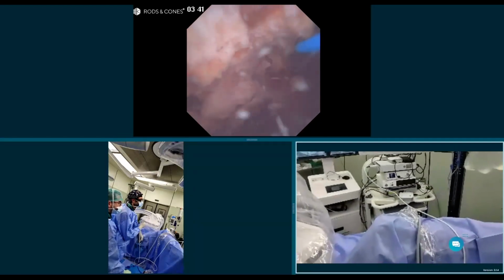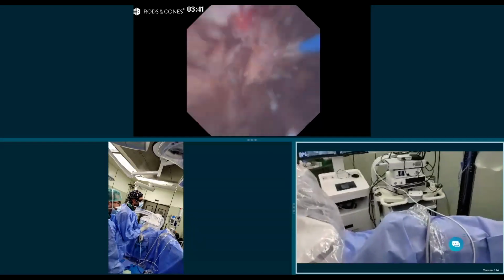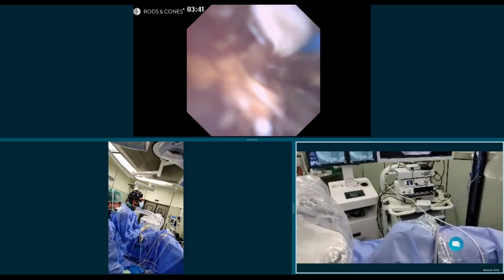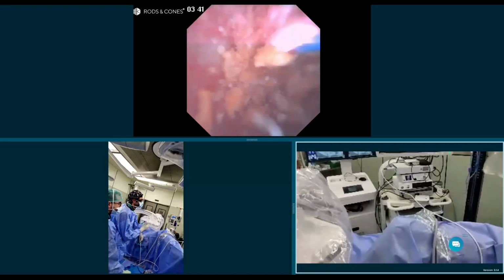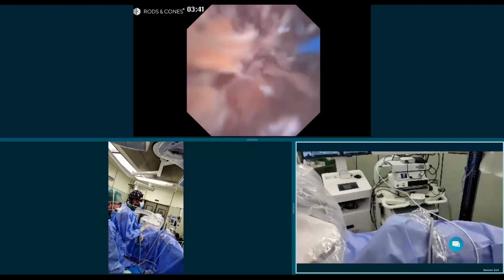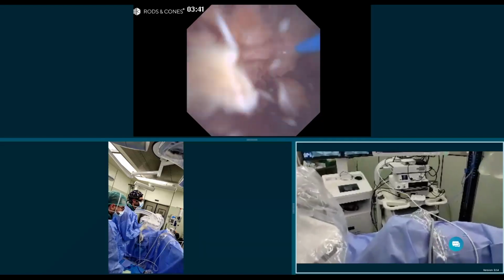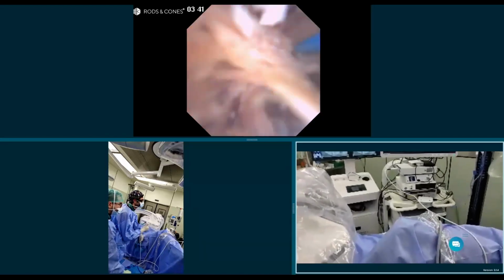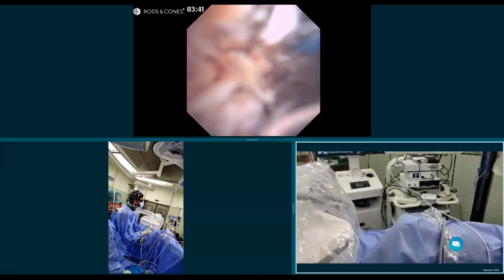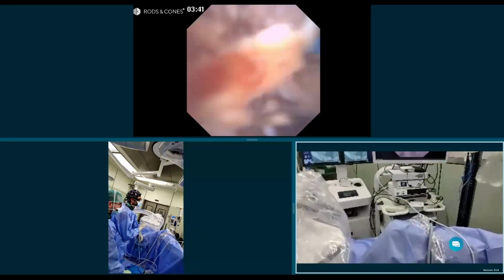So the stone was 1.5 centimeters. I think it's a mixed stone. We'll figure that out at the end with some analysis. We like to analyze the stone always to give the patient some kind of recommendation to avoid recurrences. This is not only about taking out the stones, but also to treat the patient to avoid any recurrences. Excellent. So I think we're doing a good job here.